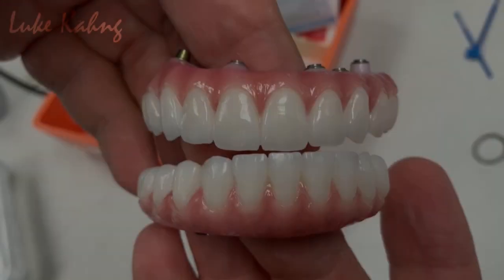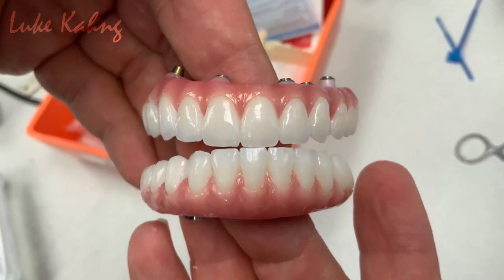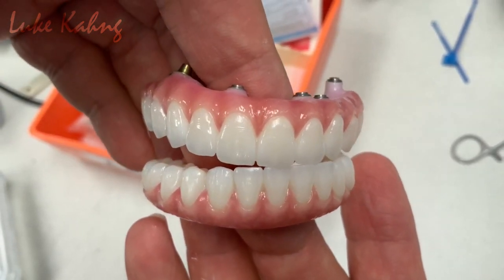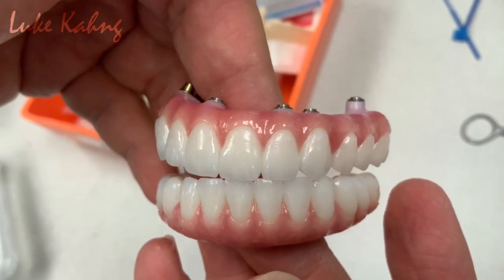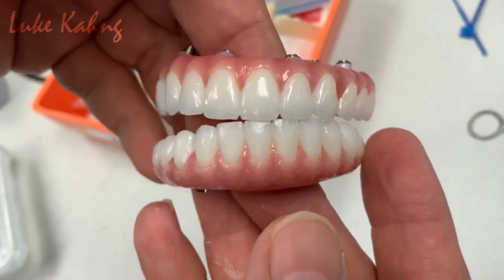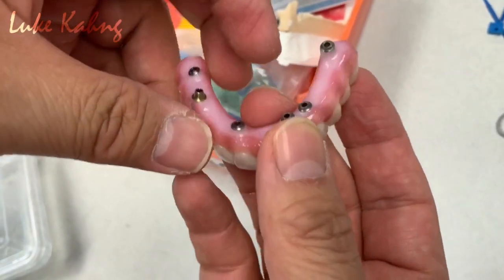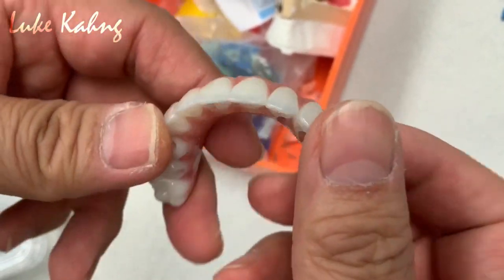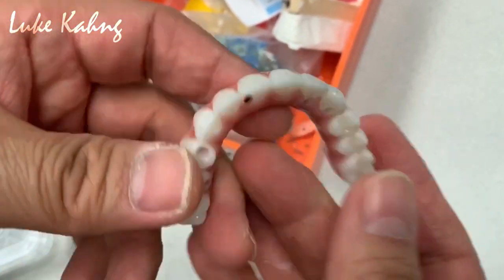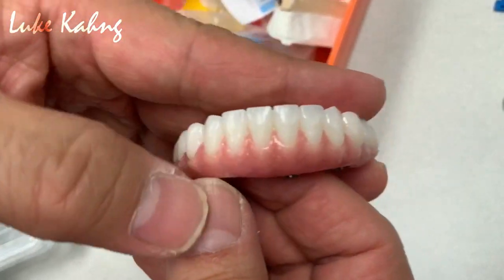Alright, great. Alright, thanks for waiting. The Saiten 4500, let's finish it. The highest aesthetics. Okay, so it's a pretty tough case, and also a pretty tough implant site. We're trying to narrow down as much as possible without compromising the aesthetics, and here's the lower.